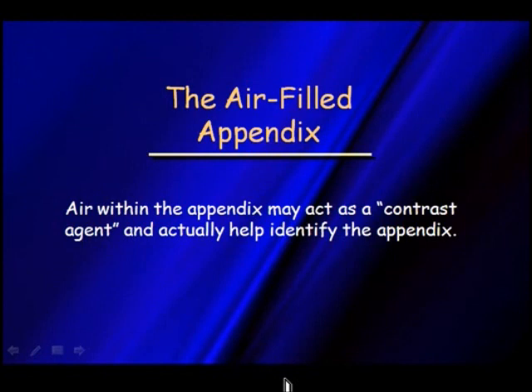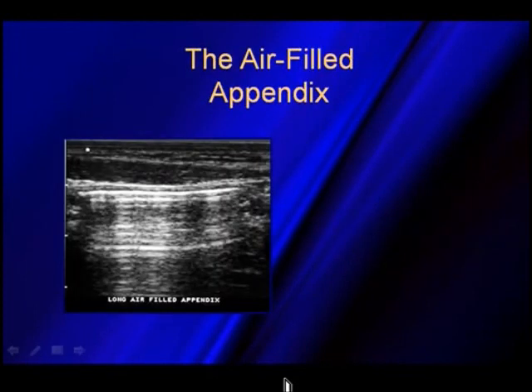Looking at air within the appendix actually acts as almost a contrast agent and helps to identify where the appendix is.